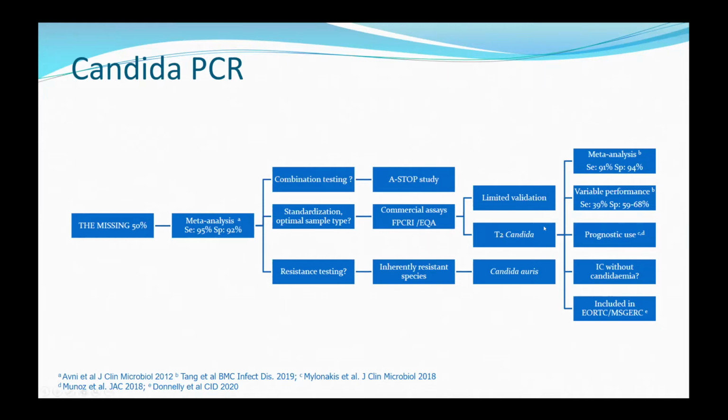When it comes to the commercial assays, most of them have limited validation. However, the T2 Candida assay does have extensive clinical validation, and meta-analyses confirm that it has a high sensitivity and a high specificity. And there is some nice evidence now that it can be used as a prognostic marker. Some of the information from the Madrid study indicated that a T2 positive was an early indication of the patient going on to develop invasive candidal disease, but also an indication of mortality in your patient.